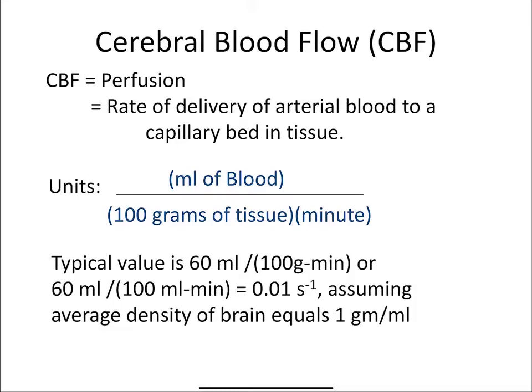How do you deal with old infarcts and dead tissue? It's not an easy thing to deal with. As long as there's blood being delivered there, the problem is that the delivery of blood may take longer than usual, right? So we'll talk a little about collateral flow down the road. It is difficult, but as long as something's being delivered, ASL should be able to measure it.